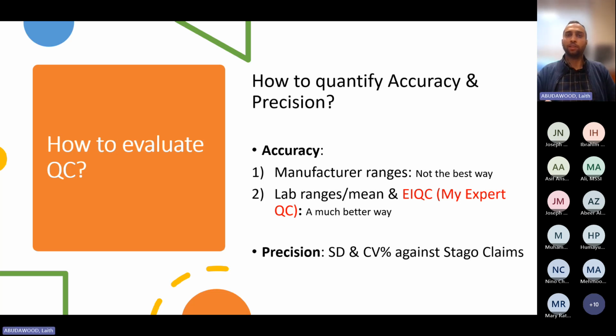For example, PT is used to control the dosing for warfarin. So today I have to give my patient warfarin. Tomorrow I have to stop the warfarin. Maybe my patient will bleed. So my analyzer and my reagents have to be very precise.